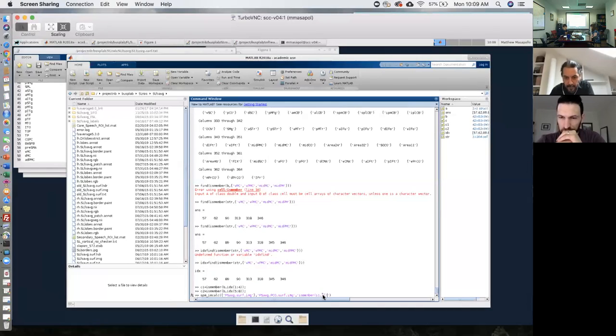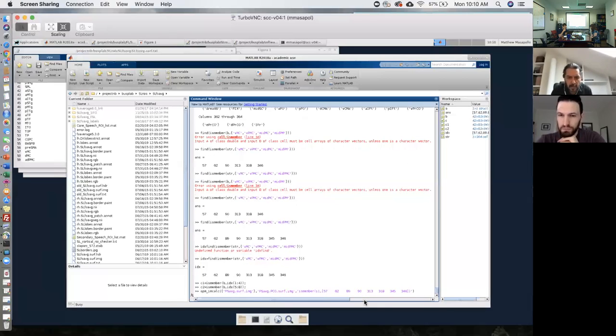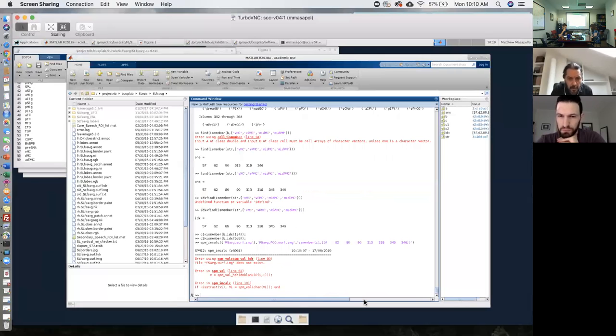I don't know if I'm in the correct location. Let me check. Nope. You're missing the 5 on 57, the first one. Thank you. Okay, so I think this should work. As long as SPM imcalc allows me to use arbitrary MATLAB commands, which I'm not totally sure whether it does.